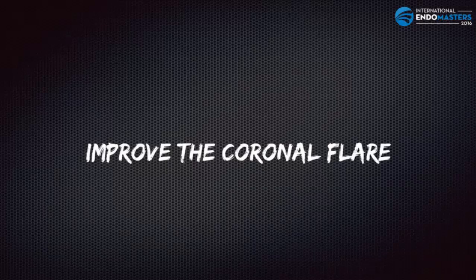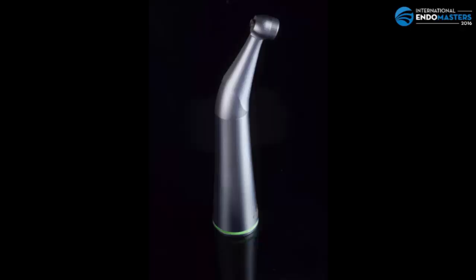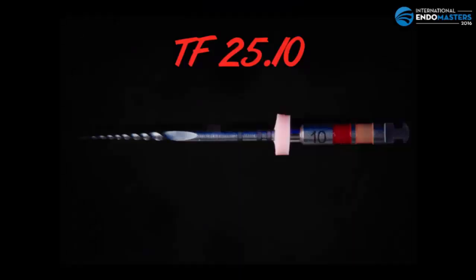Well, what I do every time is I use the motor in the normal TF function at 500 RPM and 400 torque. It's going to be gram-centimeters. I use the normal contra-angle. This is the contra-angle that they already use all the time. And this is the file that I use.